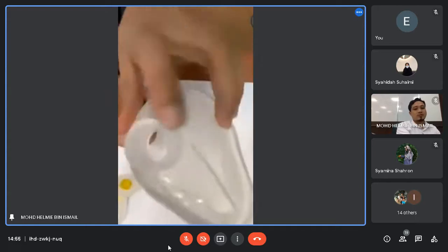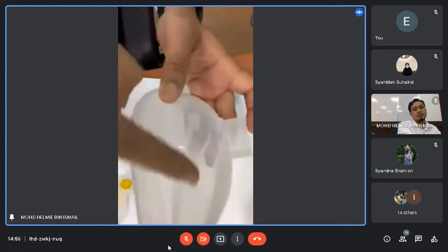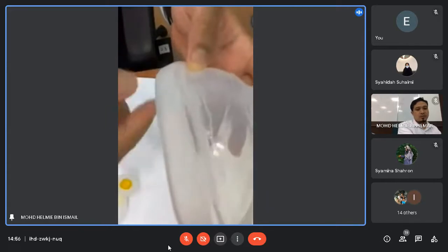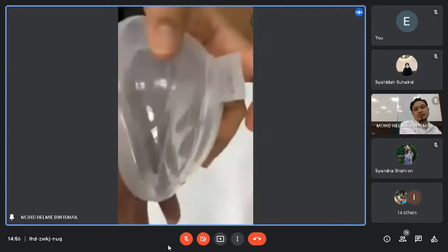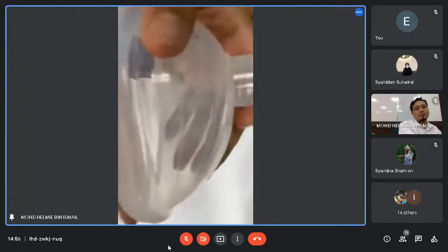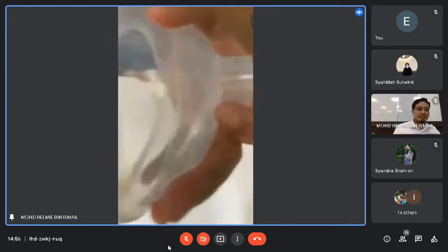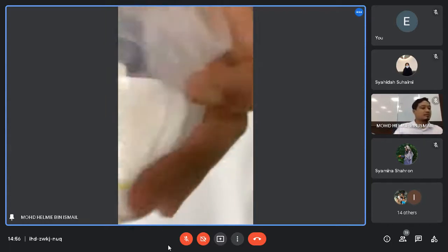So you have an airway orifice, and then the hard shell, and this one is the soft part of the mask. Basically, why is the part soft? Because it needs to properly fit the surface of the patient's skin, in order to prevent leaking.